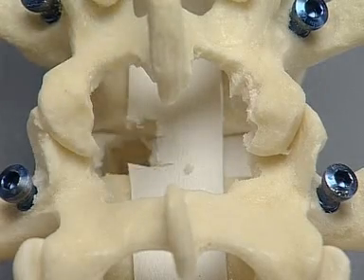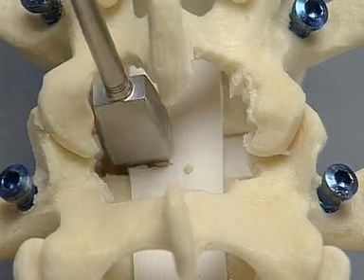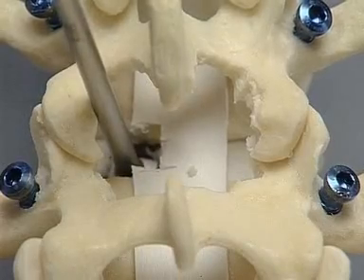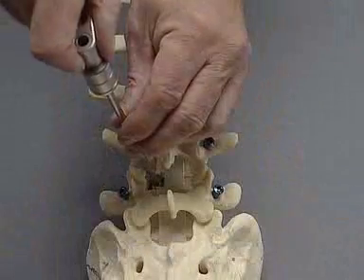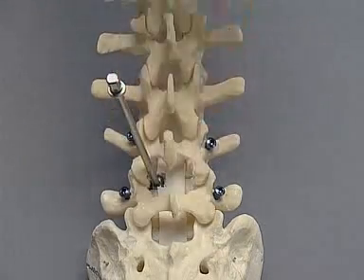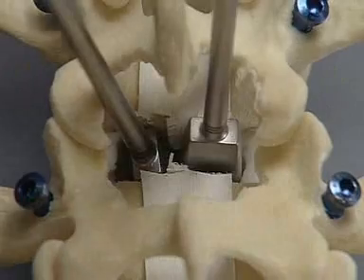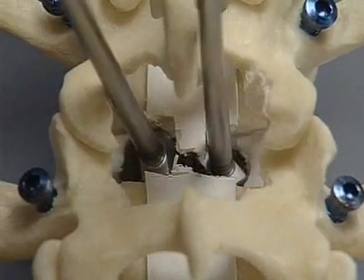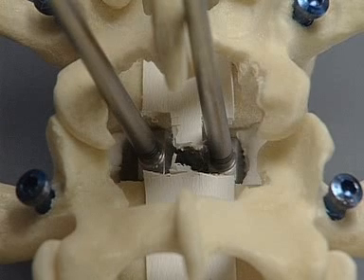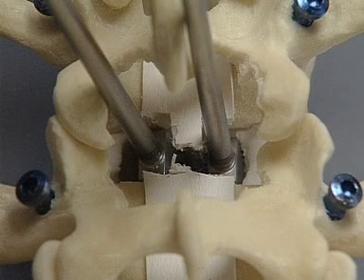The opener is removed and the smallest vertebral body spreader is inserted until the laser marks on the spreader are flush with the posterior edge of the vertebral body. Then the spreader is turned 90 degrees to spread the disc space and the handle is removed. The spreader one size larger is introduced on the other side. Progressively bigger spreaders continue to be inserted from alternate sides until resistance from the remaining annulus is felt. The disc space has now been enlarged to its natural height. A radiograph should be taken at this stage to ensure the spreaders are in the correct position, at the midpoint of the vertebral disc space.